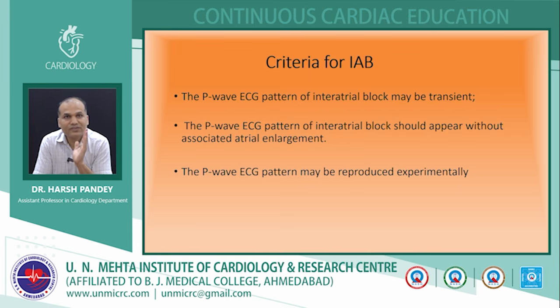Second thing, the P wave in the ECG of interatrial block should appear without any associated atrial cardiomyopathy or atrial enlargement. That is the second thing. The third thing is that the P wave pattern may be reproduced experimentally, if at all it has been done.